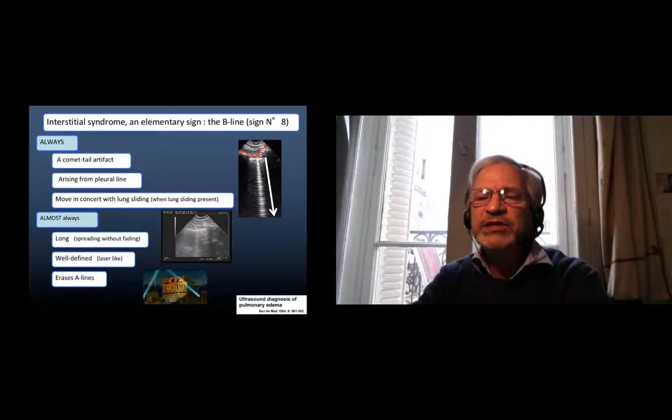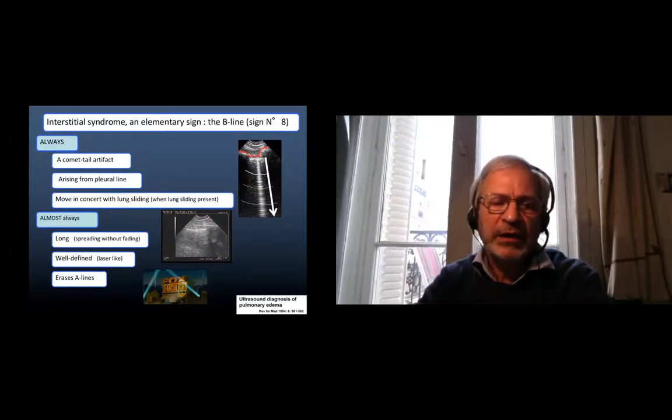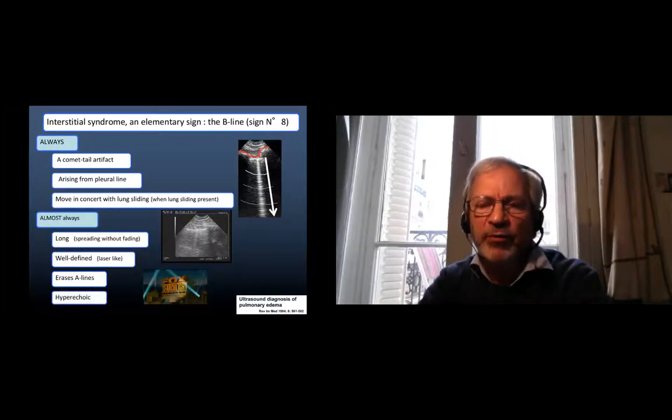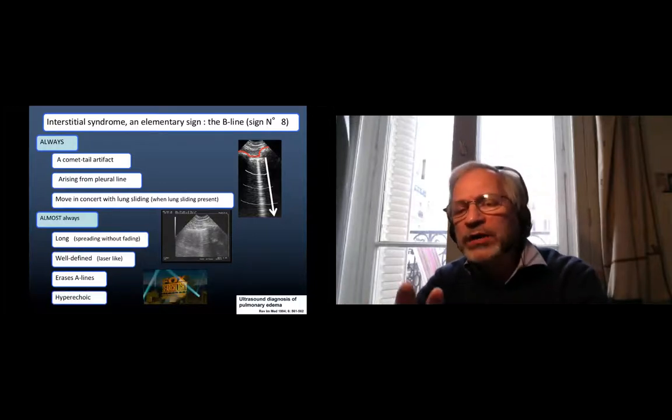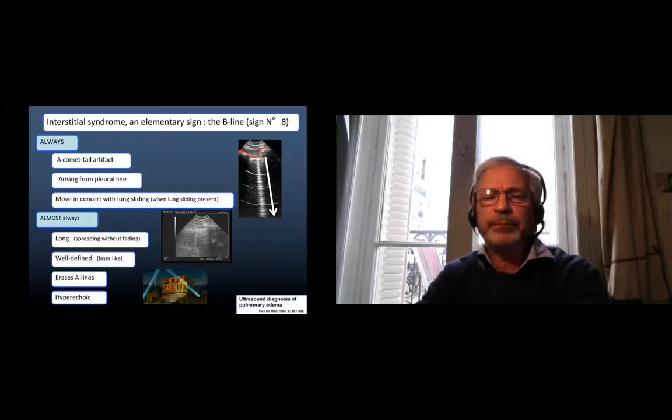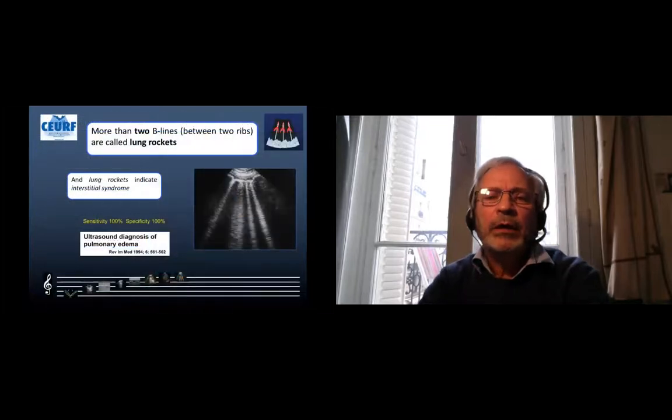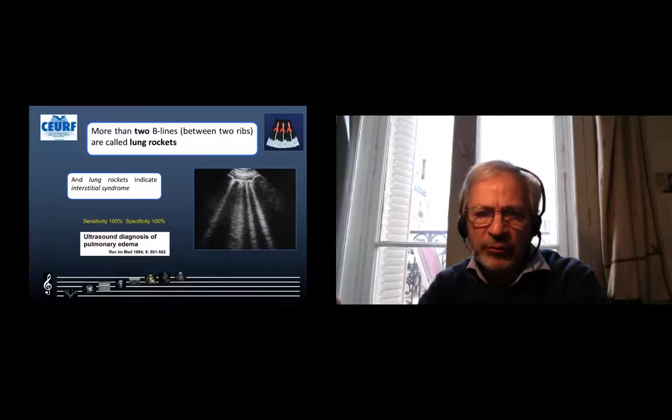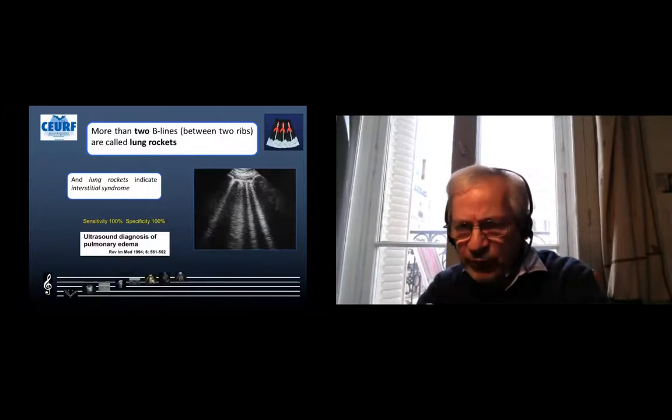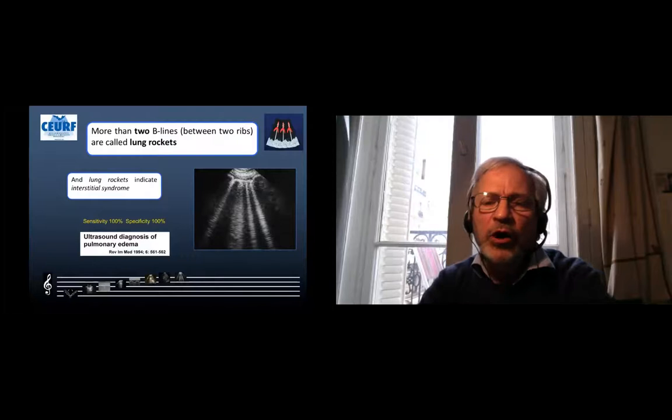Almost always it erases the A-lines that should be located at these areas. Almost always it is hyperechoic, that is white like the pleural line. More than two B-lines between two ribs, that is in a 25 millimeter view, are called lung rockets. Lung rockets indicate interstitial syndrome with full accuracy.